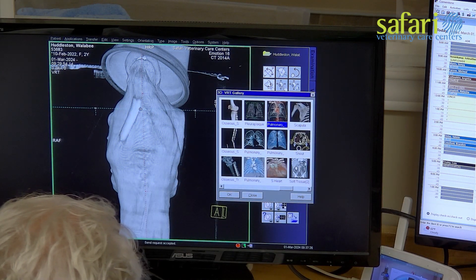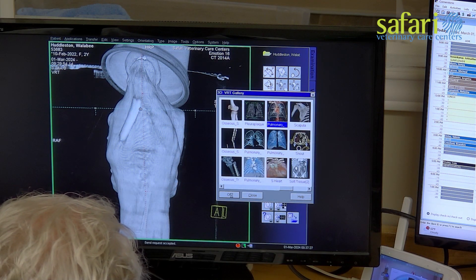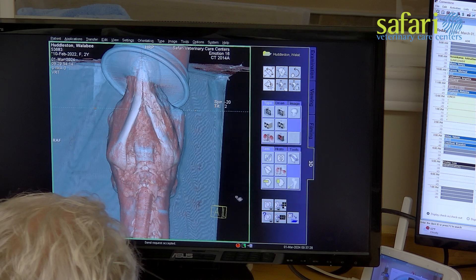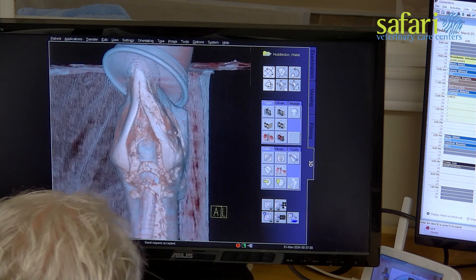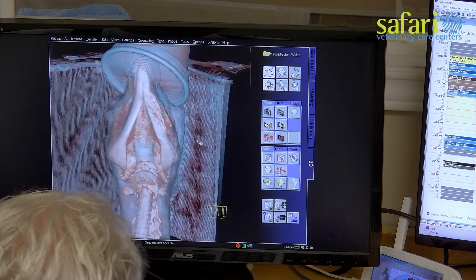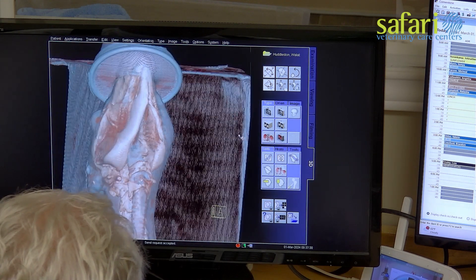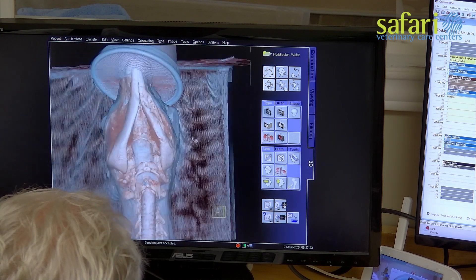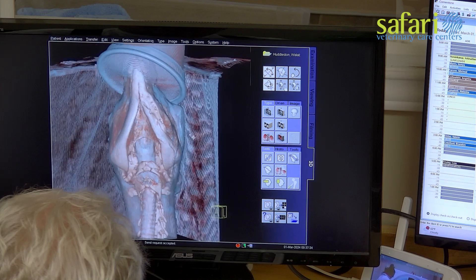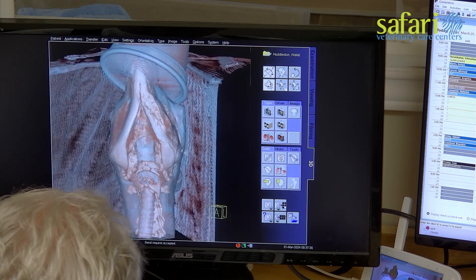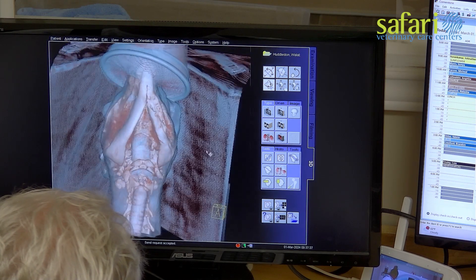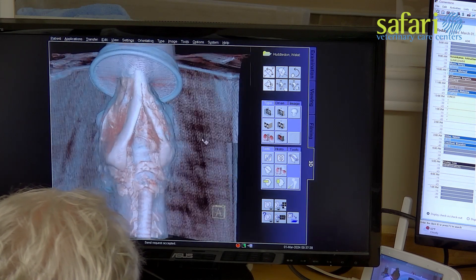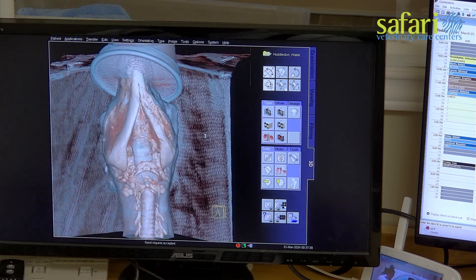After the scan, the image is initially viewed in black and white and set up to be symmetrical so that one side can be compared with the other. On the screen, we can see the teeth, upper teeth, eye sockets, and nasal passages of the wallaby.